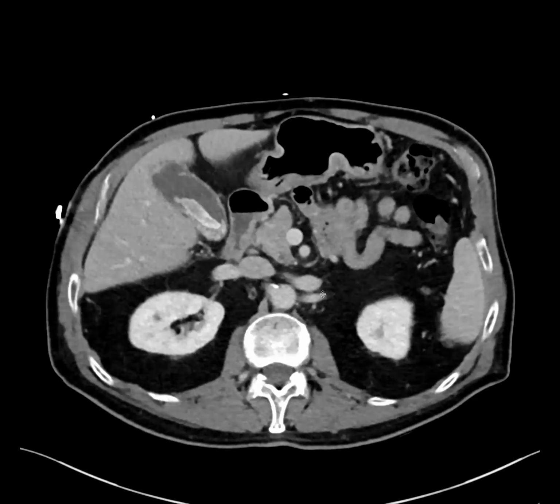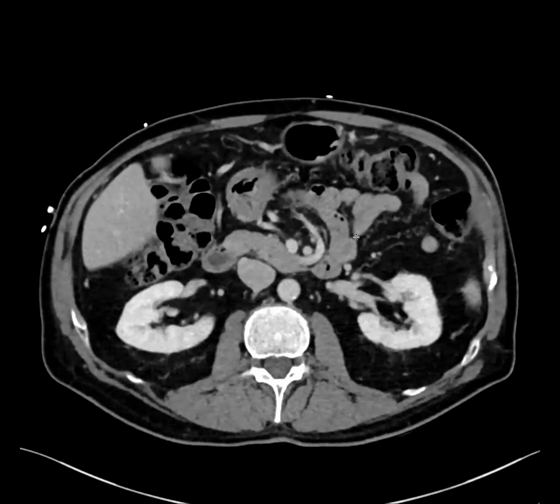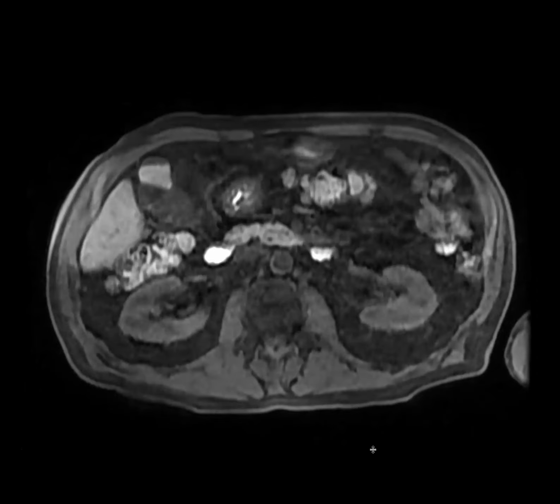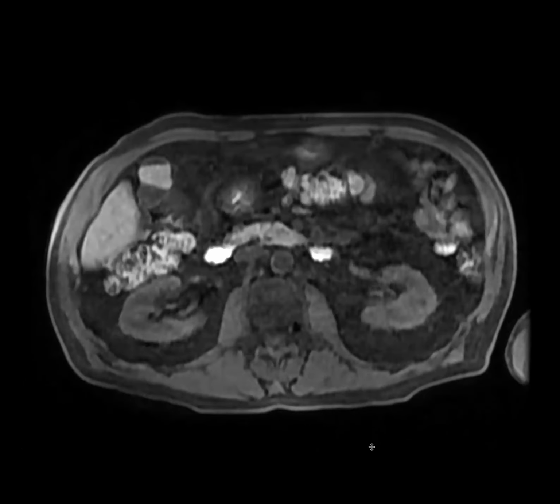Ooh. So it's just a fake out. On MRI, bile that has a gradient to it isn't necessarily sludge. Because if you just take bile and stick it in a beaker and then have it sit for a while and put it in an MRI, it can form a gradient like that, even though it's not semi-solid. Yeah, we call it hyperconcentrated bile versus sludge.